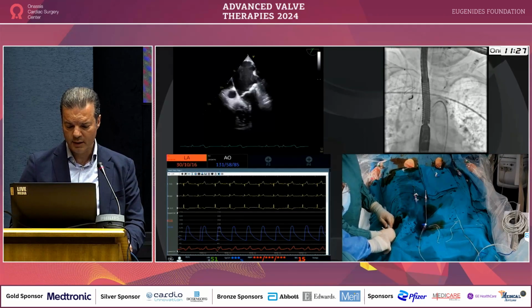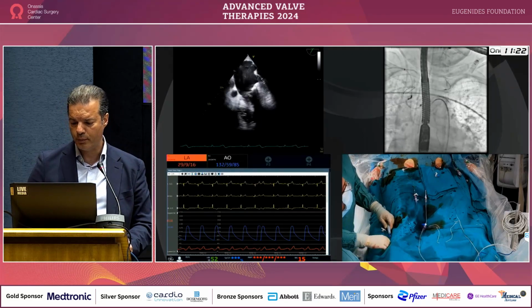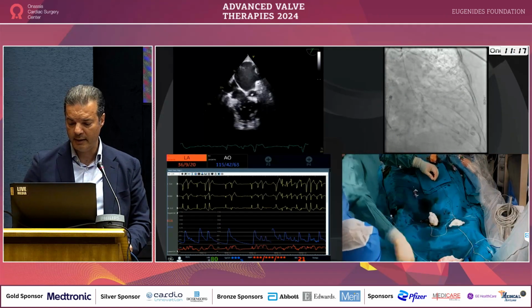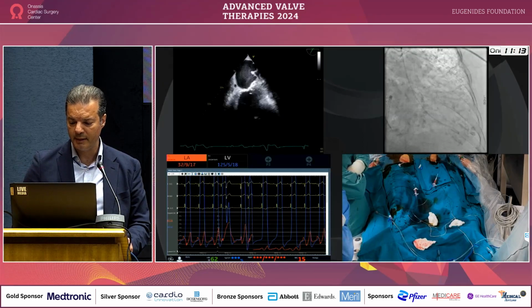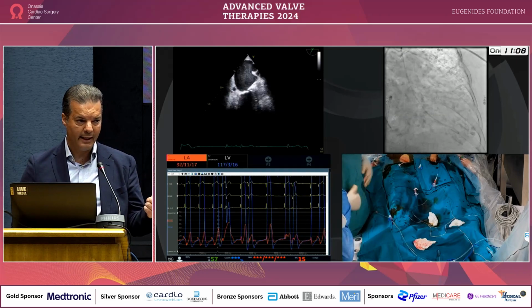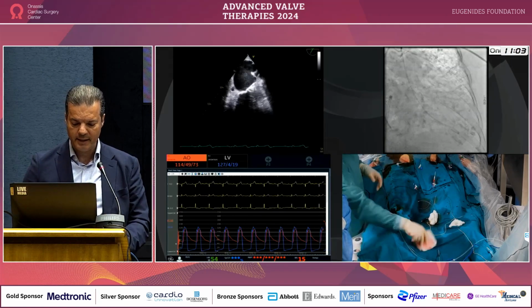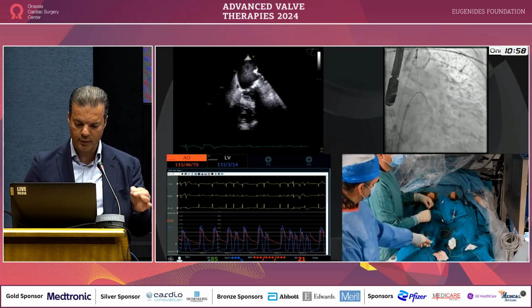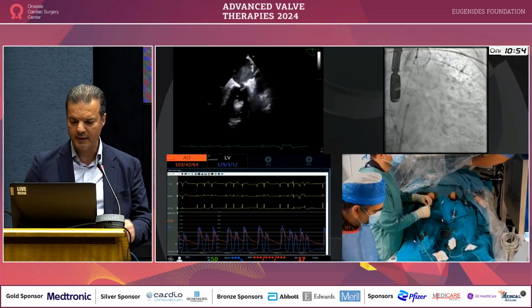Once we did that, we had the transseptal and the Sentinel implantation, then our setup was to put an LV catheter through the left femoral artery. We had it also prepped for a potential balloon pump implantation or hemodynamic support. This way we had simultaneous pressures from the LA and the LV and also from the LV and the aorta. You can see that at baseline there was no gradient. For pressure calibration purposes, the LV was slightly higher than the aorta, and we took that into account.